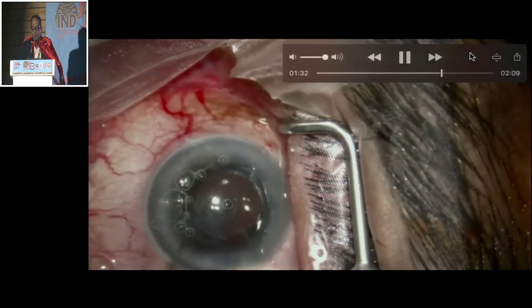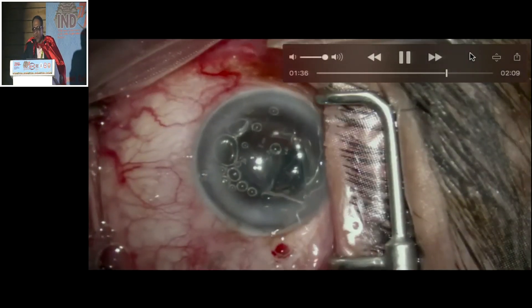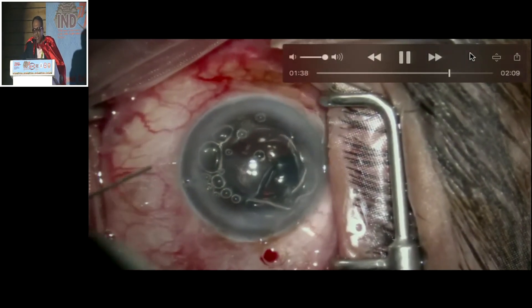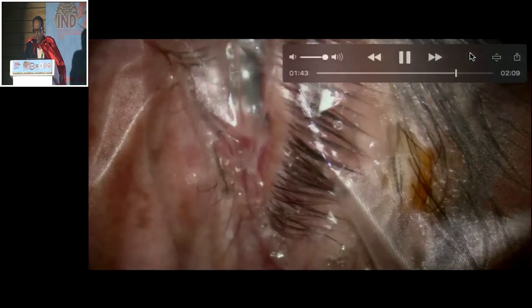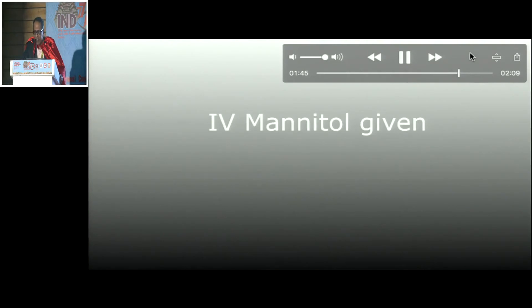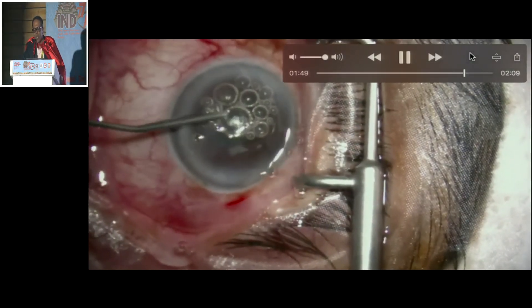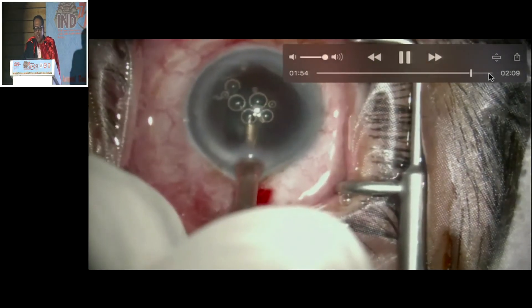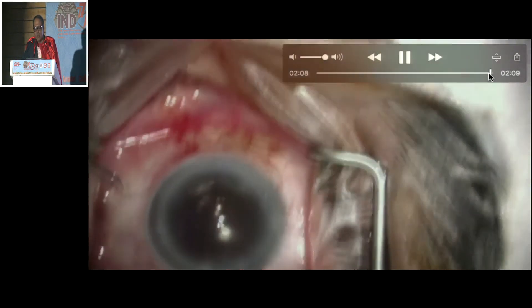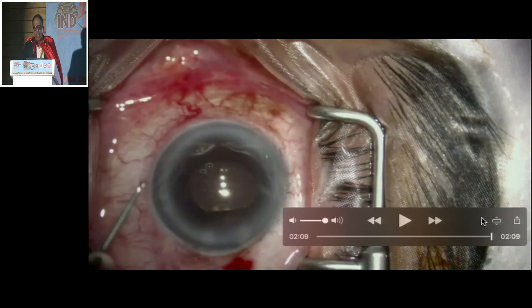Had vitreoretinal support been there, I could have put a trocar and done a vitrectomy, and the misdirected fluid would have come out. I give IV mannitol, get the fundus examination done, rule it out, and find that it is back to normal. The case is continued and without any issues we have the best results. I think it is high time the work speaks rather than talking about how I am going to become the king. Thank you very much.